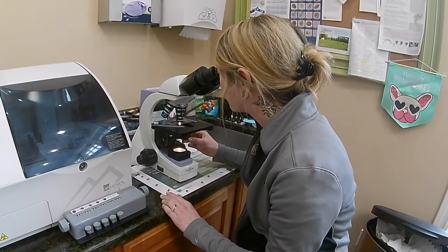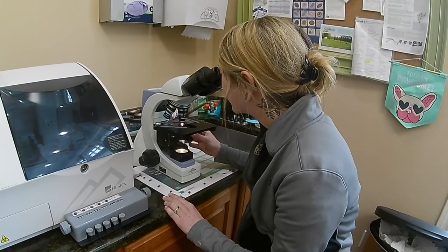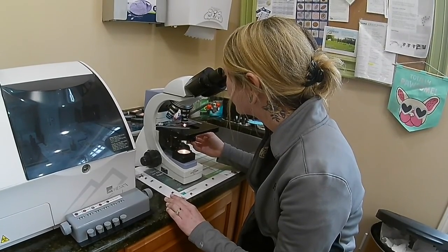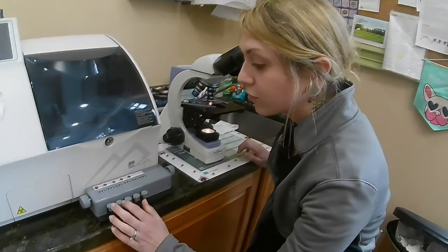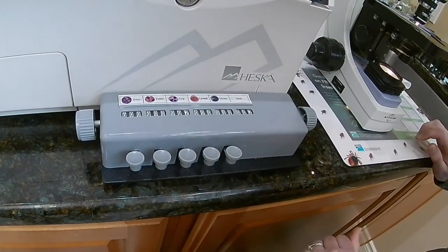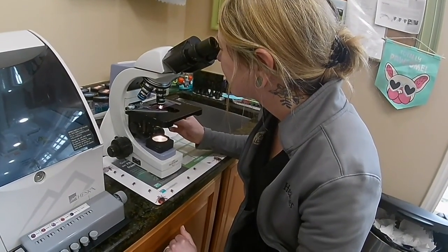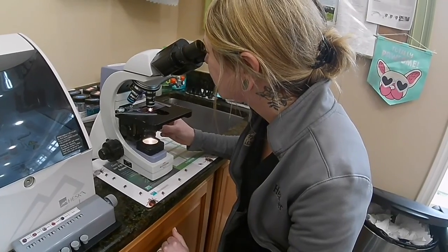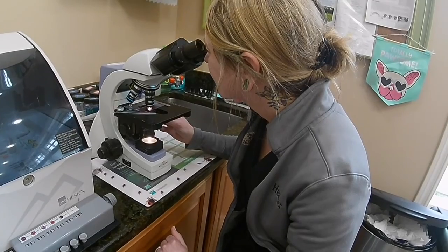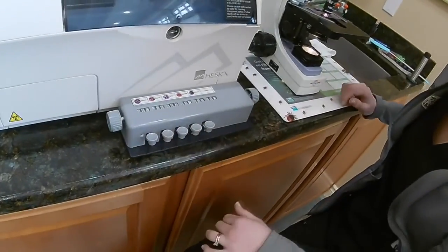So, I'll go through and look around. For example, in this particular field, I'm seeing 2 neutrophils. So I'll come over here. I'm assuming press that there, and we're going to keep going. I'll do another one here, and then we'll touch base about platelets. Actually, right there, that's looking like a lymphocyte. So we'll hit that.